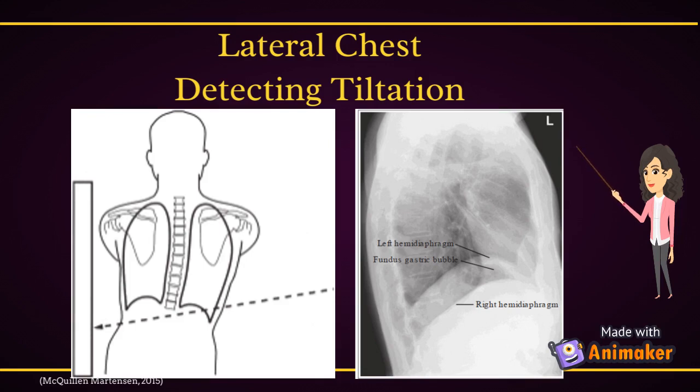As I mentioned before, to obtain a lateral chest image without lung foreshortening, position the mid-sagittal plane parallel with the image receptor. When imaging a patient with broad shoulders and narrow hips, it is essential to maintain a parallel mid-sagittal plane by positioning the hips away from the image receptor.